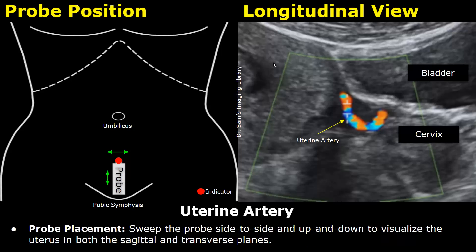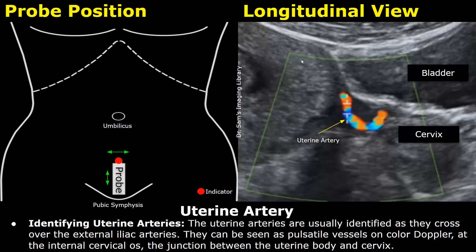Our main focus here is to locate the uterine artery. First, keep the probe in the midline in this manner, then sweep the probe side to side and also up and down to visualize the uterus. Focus on the area between the uterine body and the cervix — that is the internal cervical os. This is the landmark where you will most likely find the uterine arteries, usually seen at this location being lateral to the midline.